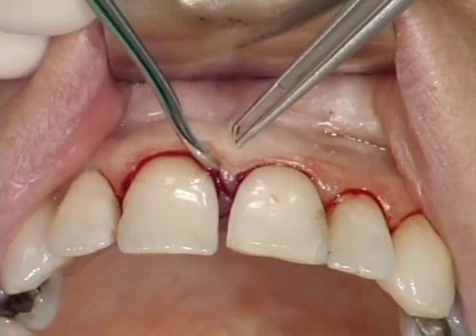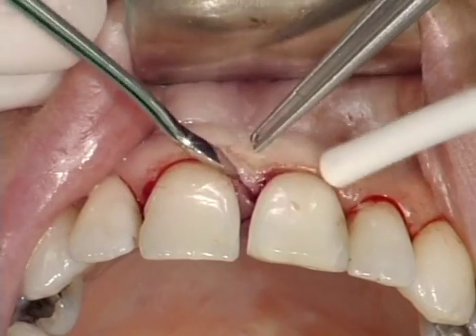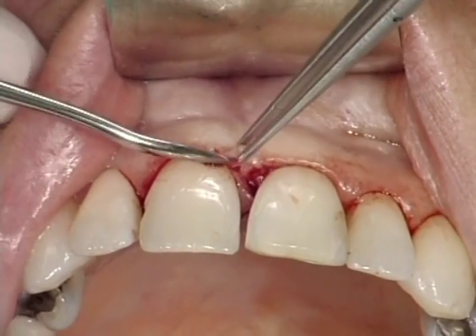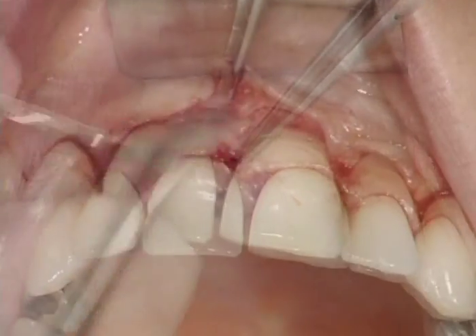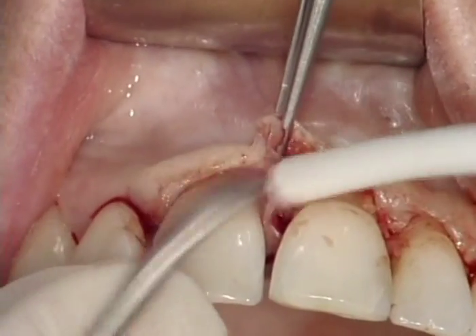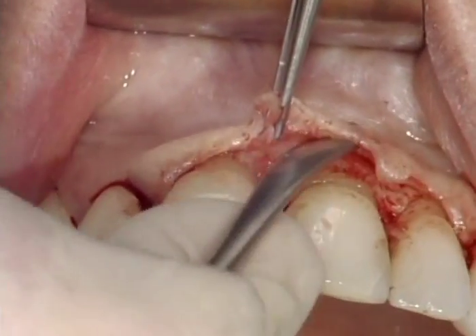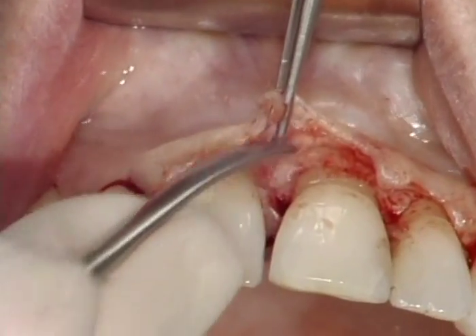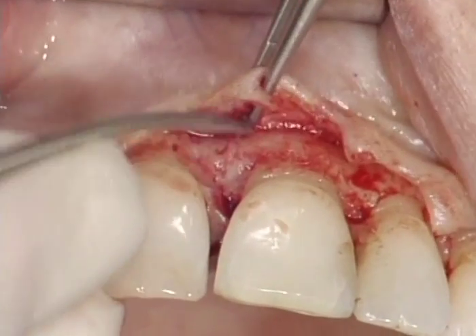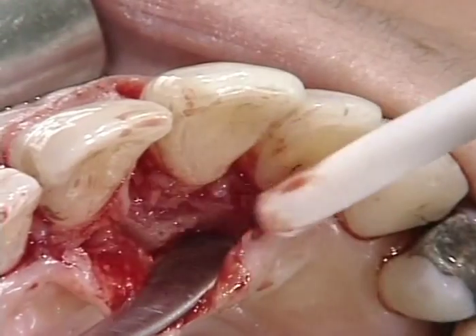A fine raspatory is used to detach the gingiva. Then the mucoperiosteal flap is elevated using a midsize raspatory. Trauma to the soft tissue is minimized to enhance good soft tissue healing.